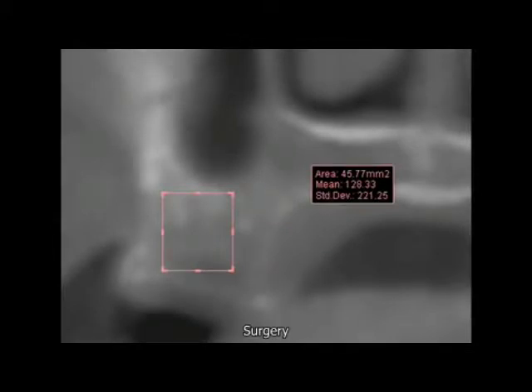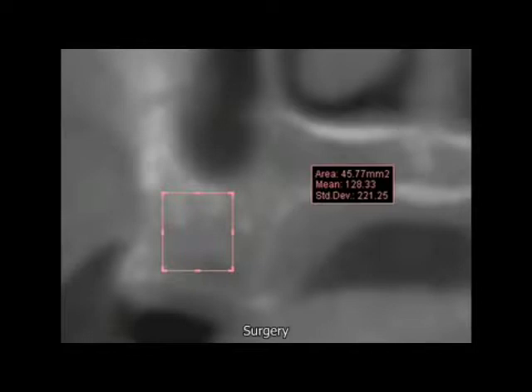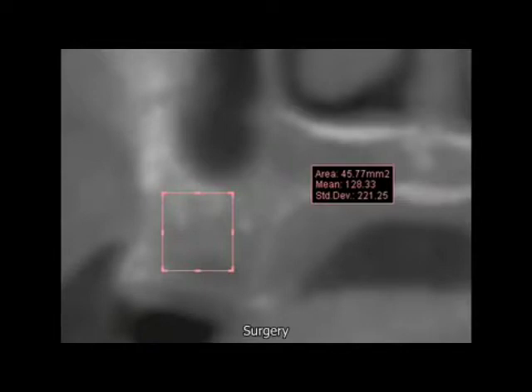Another problem we have, beside the 1.5mm to 2mm shortage of alveolar bony height under the sinus floor, is that the bone density for this patient is very low. Looking at this image, the mean average in the outlined square of this cross-sectional slice is around 130 Hounsfield units, which falls into density type 4 — very weak.